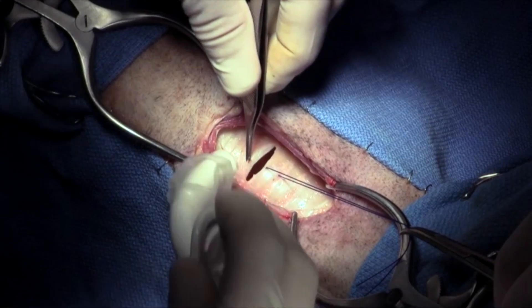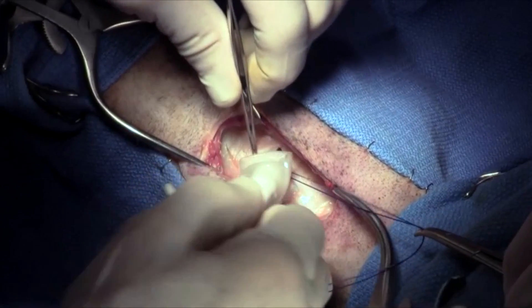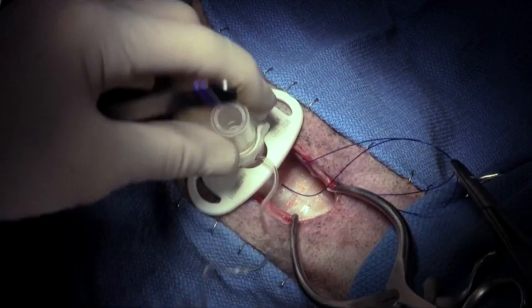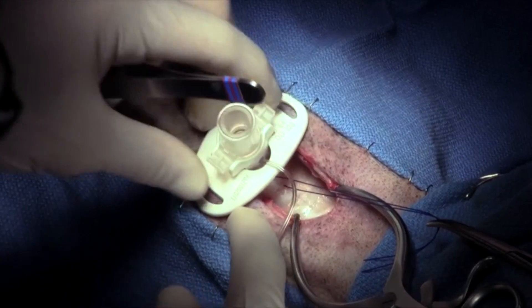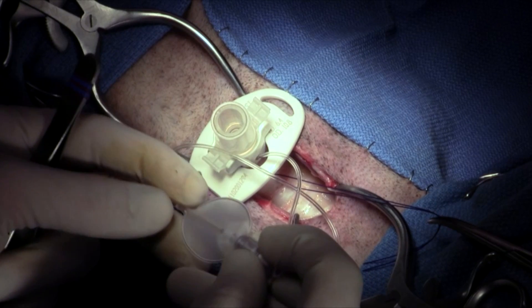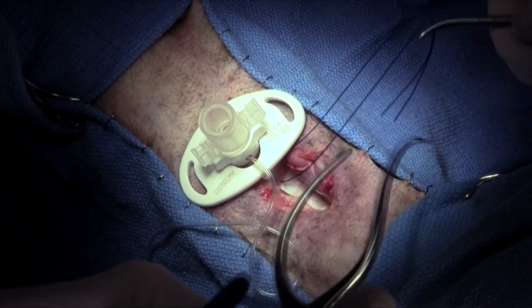The tracheostomy incision has been made and placement of the tracheostomy tube is being attempted. The tracheostomy tube is now in place. The cuff attached to the tracheostomy tube is not inflated under normal circumstances. The cuff is inflated only if anesthesia is being administered through the tube or if the animal is being placed on a ventilator. The Gelpi forceps are being removed.